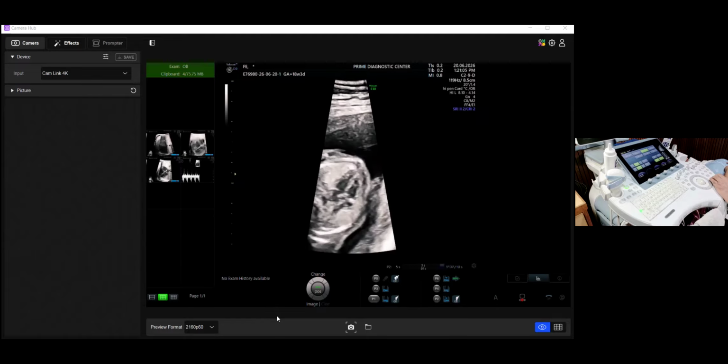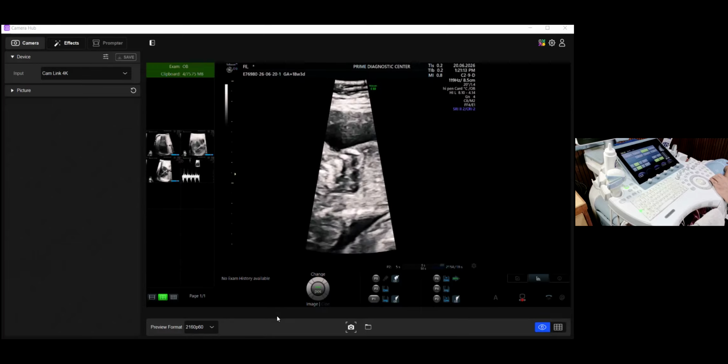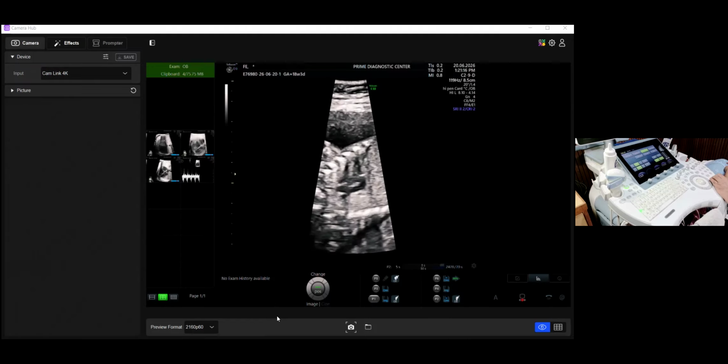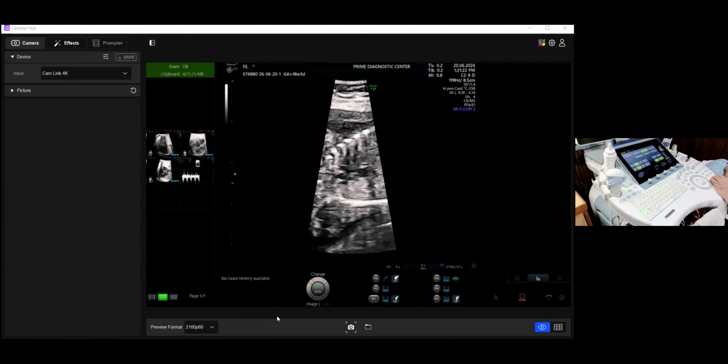So now we started getting the apical view. Let's attempt there. That's an inferior vena cava. Right, so you see the superior vena cava there? And let's try both together.